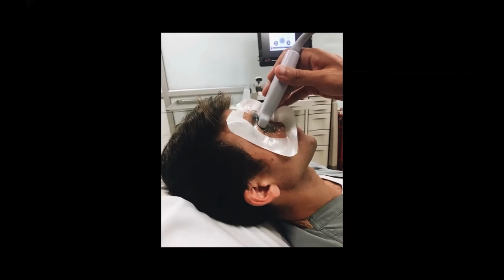One technique that I read about that I haven't tried, which may actually provide some benefit, is taking a petroleum jelly based product and putting a little bit in the medial and lateral canthus, maybe smearing it on the eyelashes, and then putting your Tegaderm down, because that may fill up some of those voids before you fill them up with air. So that may be an alternative to shoot for, but I've belabored that point, so we'll move on.